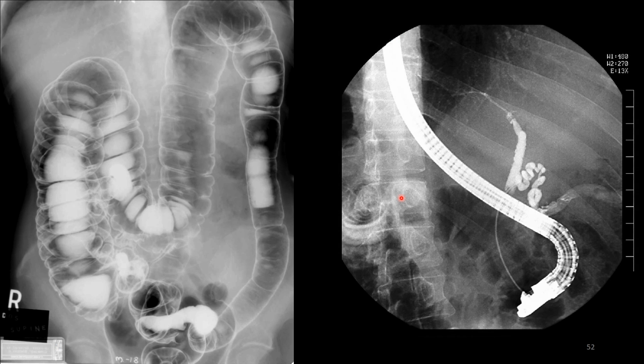So we've got an example of a barium enema. So this is the contrast pooling in the bowel. I don't know whether this is a supine or a prone view. Supine means that you're laid on your back, and prone means that you're laid on your front or on your tummy. And so you can see the contrast. This is the barium, the liquid barium. And the darker areas that you're seeing are air, and you can see that the barium's passed all the way around the bowel quite nicely, and it's coated it really well, so you can see all of the anatomy.